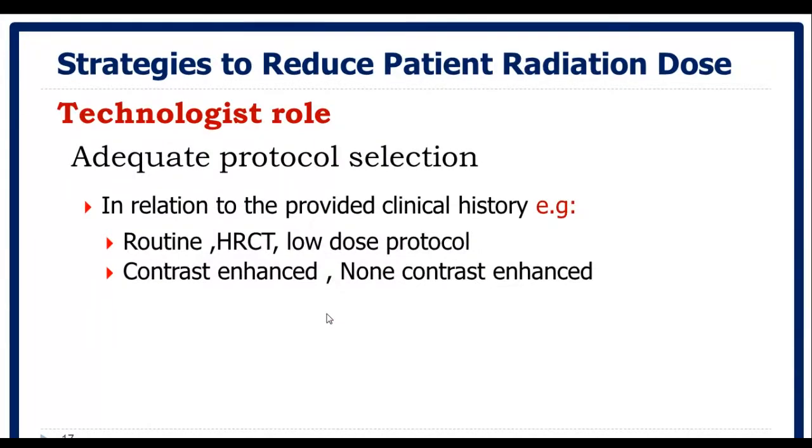Also, the technologist is responsible for adequate protocol selection in relation to the provided clinical history. Is it routine, high-resolution CT, low-dose protocol, contrast-enhanced, non-contrast enhanced, and this is in consultation with the radiologist and the referring physician.